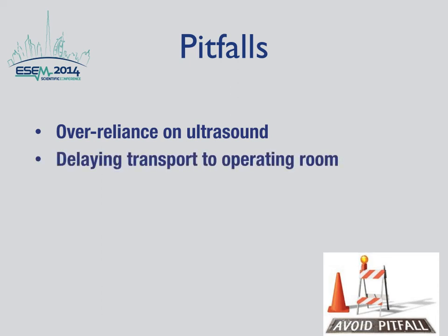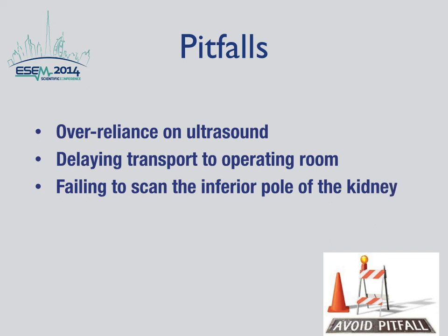Another important pitfall is delaying the transport to the operating room. When immediate surgical intervention is clearly indicated, such as evisceration injury, you don't need to do an EFAST exam. You can skip and the patient needs to go to the OR. Another pitfall is failing to scan the inferior pole of the kidney. The free fluid will start to accumulate closely to the inferior pole of the kidney, and if you don't interrogate that area, you might miss positive free fluid.